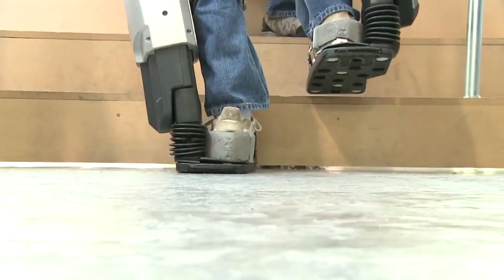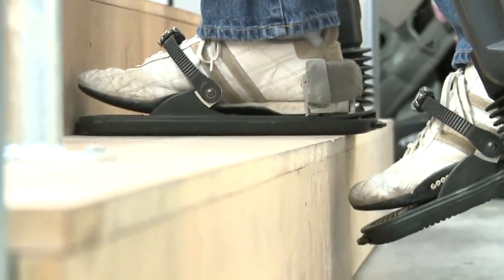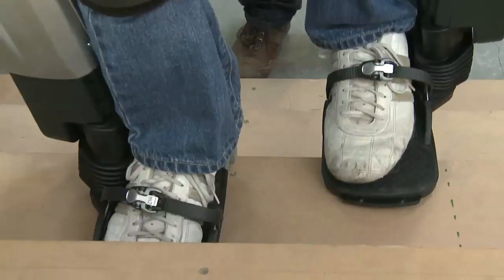Going to see the girlfriend — she's got five stairs to get into her place, so it'd be nice to actually walk into her place one time instead of having to bum myself up the stairs, one stair at a time, and have her laugh her head off at me, especially when it's pouring down rain.